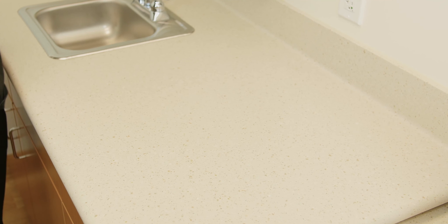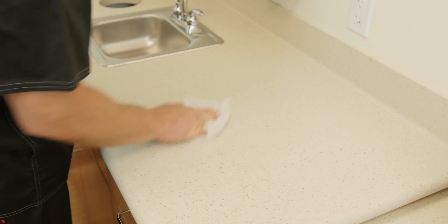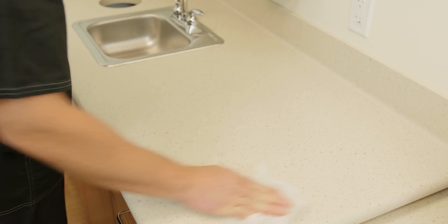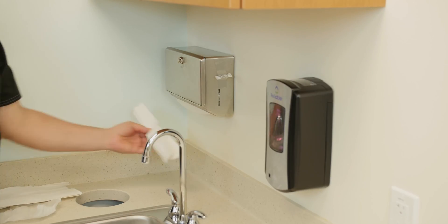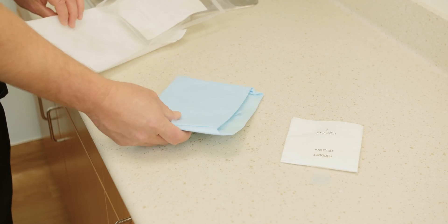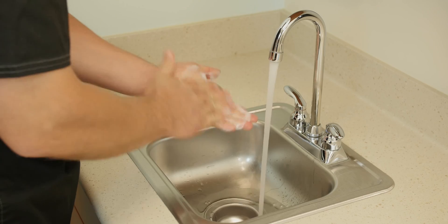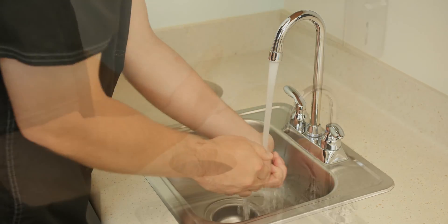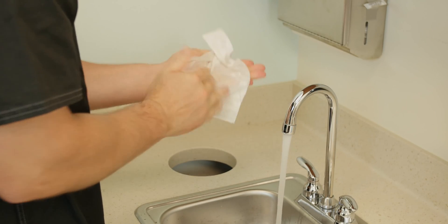First, you must prepare a clean workspace. Clear a space on a table or counter for your drainage supplies. Clean the surface with a disinfectant wipe or paper towel moistened with rubbing alcohol. Wipe the surface dry with a fresh paper towel or allow it to air dry. Place the supplies on the cleaned area. Wash your hands with warm soapy water for at least one full minute, rinse thoroughly, and dry your hands with a clean towel or paper towel.